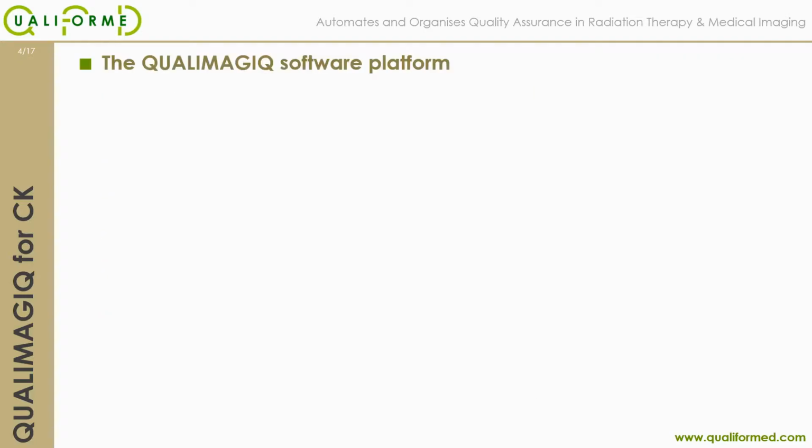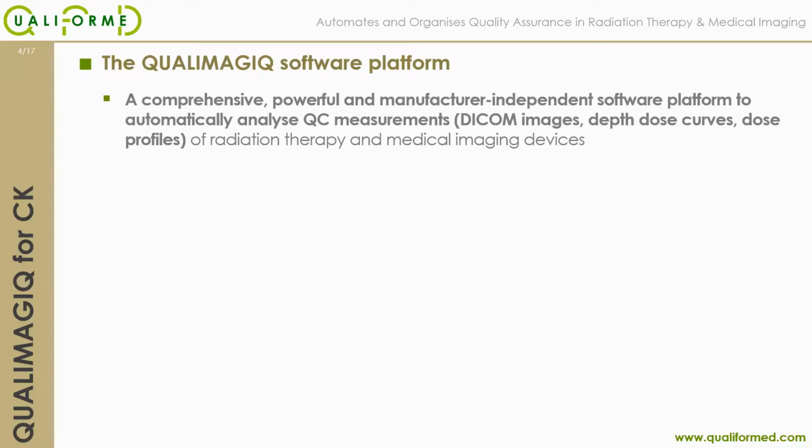The QUALIMAGIQ platform is a generic platform used for medical imaging and radiation therapy in order to automate analysis of quality control measurements, DICOM images, depth curves and profiles.